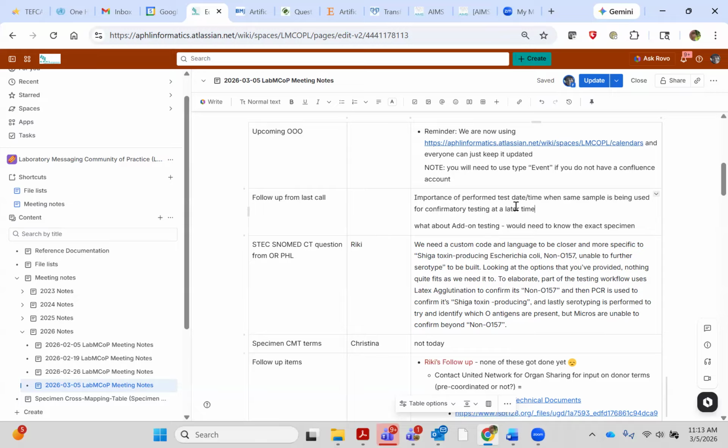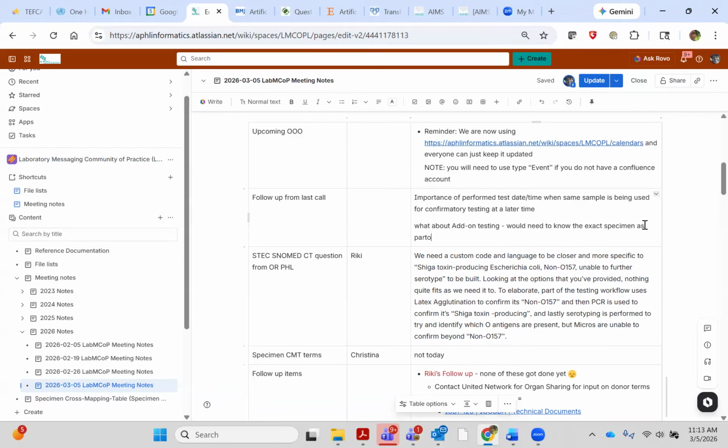Okay, I guess I'm still not getting it, but that's all right. You have the same sample and two different test methods. You do screening tests, like a drug screen, drugs of abuse on urine from the ER. I used to do these, and the community hospital I was at didn't have toxicology on site to do the confirmatory, so we'd send it off to med tox across town at a reference lab. When I was at Duke, we could do those on site.